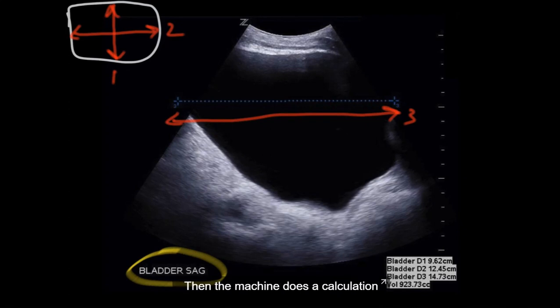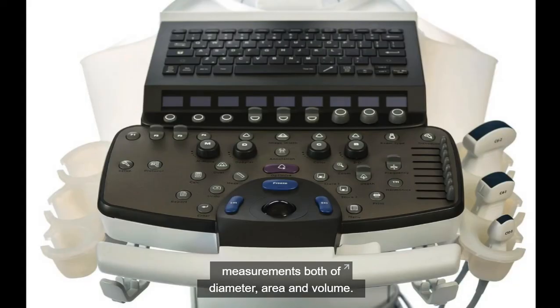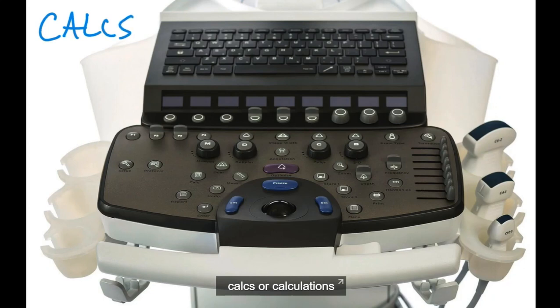Then the machine does a calculation and reports out a volume of 923 cc's. Now we'll cover the specific application of a bladder volume when we review the renal and bladder module. But for now, this is just to illustrate that the machine is capable of doing measurements both of diameter, area, and volume.